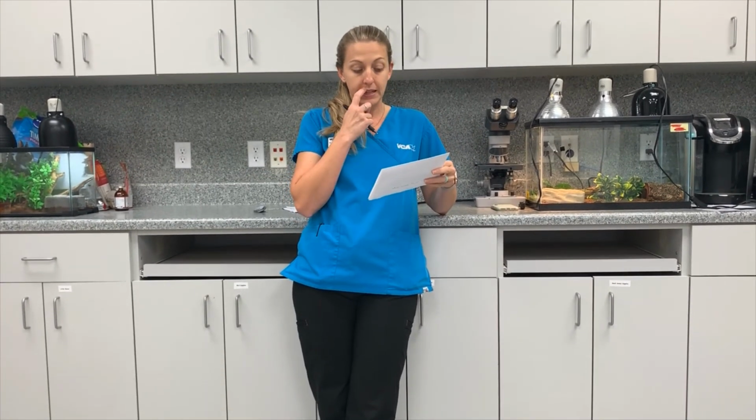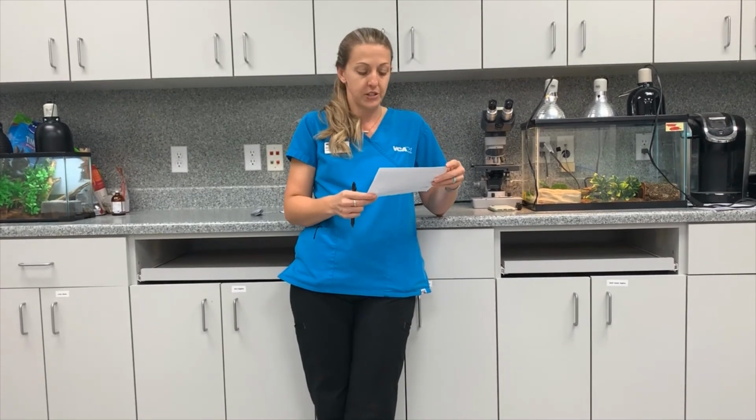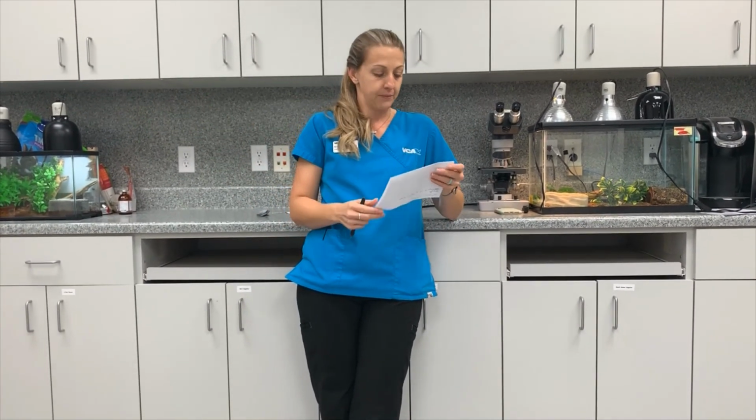Carly's biggest strengths at this point are her technique. She does a great job picking those techniques and changing when needed, and also getting those radiographs on that first try without having to redo things multiple times to increase exposure to the animals. The weakness that we've dealt with Carly is a little bit of that collimation, just making sure we only get the bones that we're looking for or just the abdomen, that kind of thing.